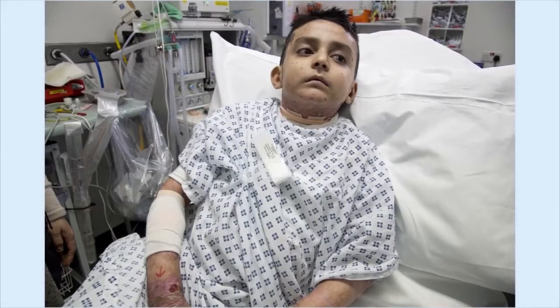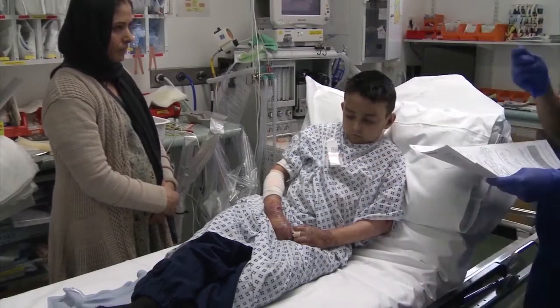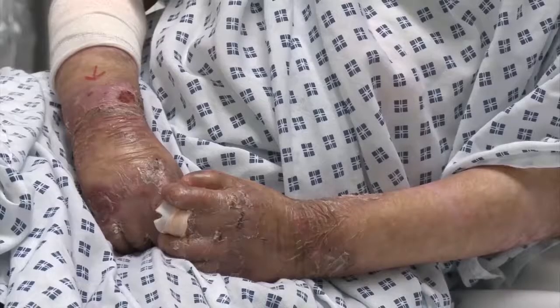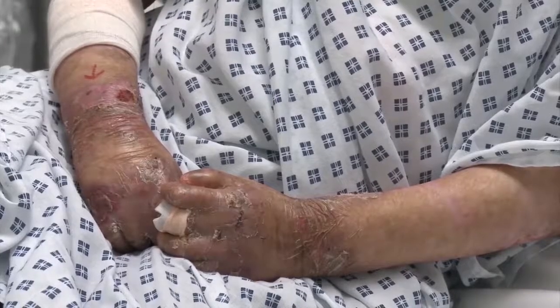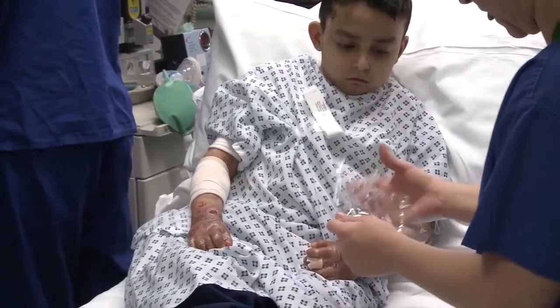Traditional hospital bracelets have sharp edges and can injure the skin, so we either pin them to the patient's hospital gown or use a photo for ID. This patient's 0.5 mg per kilogram of midazolam pre-med has worked well. He is sedated, but still cooperative. It is clear that the intravenous access is a challenge, and so we have elected for a gaseous induction.